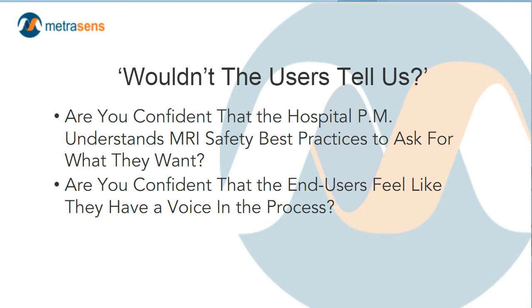One, if we're all working from the same resource materials, right? What does the Joint Commission and the ACR require? What information do I get from the OEM? What's in the existing building codes or design standards for MRI facilities? If we're all using the same resources, it may be that the end users, the hospital employees, may not have a clear indication as to what best practice, as it would apply to them, is.